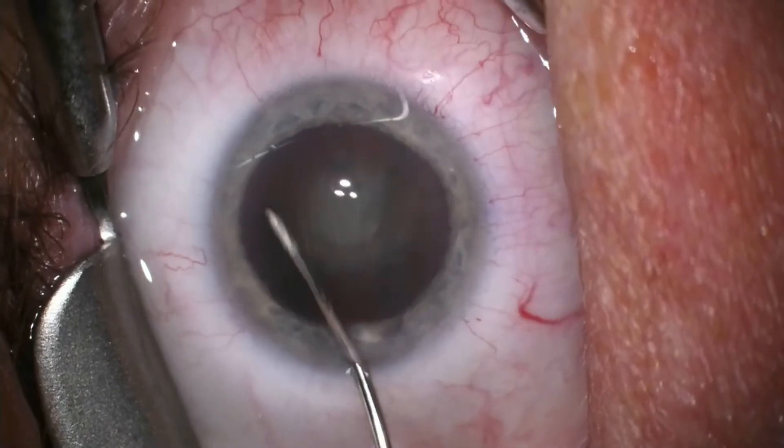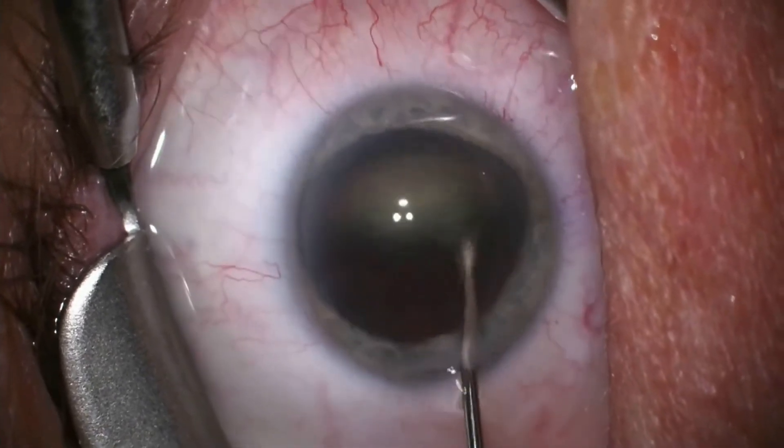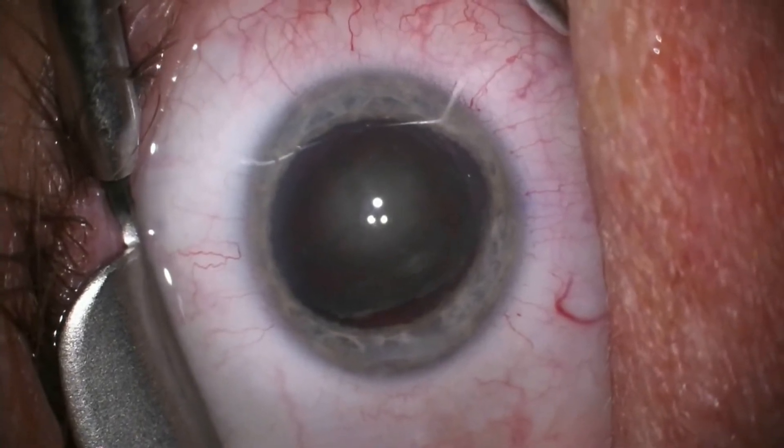I am inserting fluid between the capsule and the nucleus of the cataract to separate the nucleus and then gently roll it over in preparation for removal.